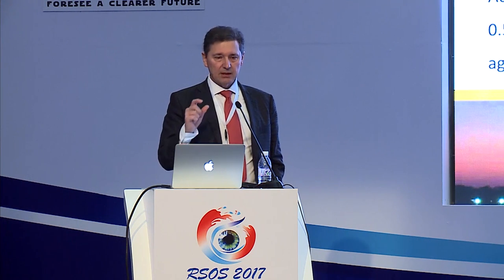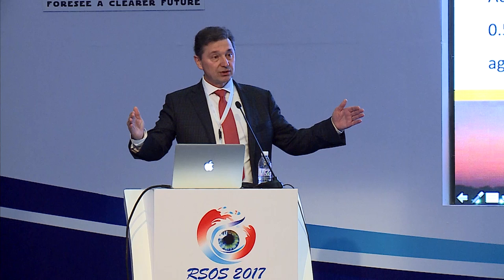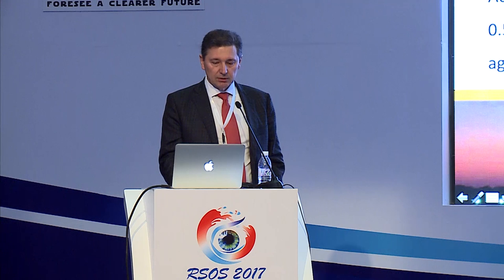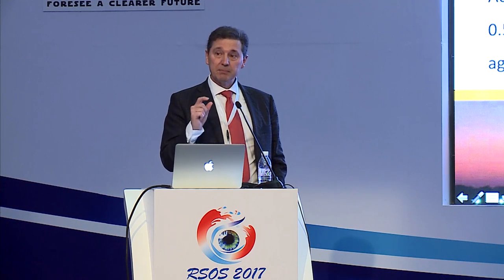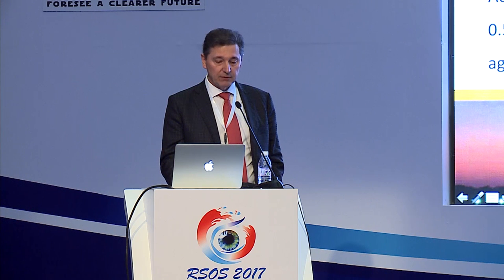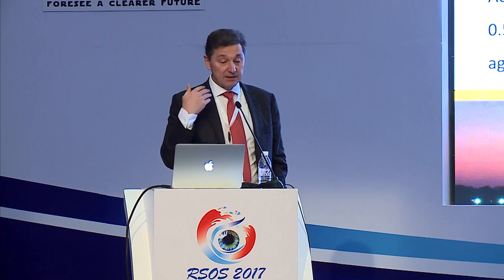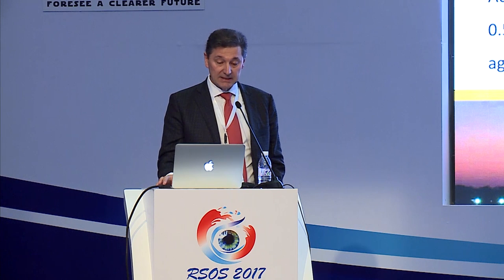And some of the things they're looking at are epithelium, like Dan Reinstein does. They're also looking at something, I hope I have it over here. This is an important point. If you look at the average K in the population, and you then go 2 standard deviations, so 95% of the population are within this range, you get up to 47.2. So people with a preoperative K of 47.2 are pretty normal. They're within 95% of people. If you add one further standard deviation, you get to 49.2. So that means there are people walking around with corneas of 49.2 with very good vision, very comfortably. So in their minds, they think we can also go to 49.2 pretty easily.